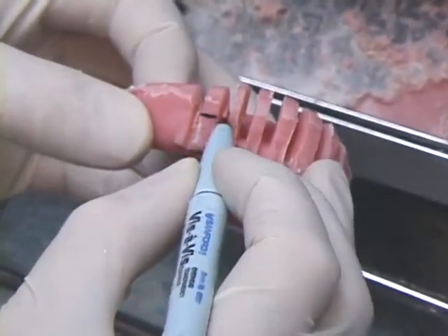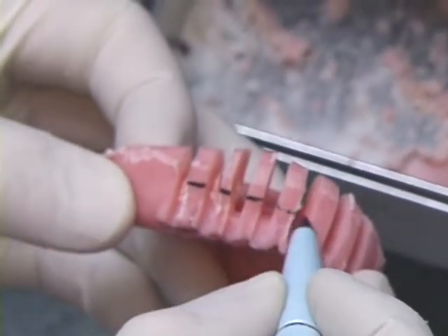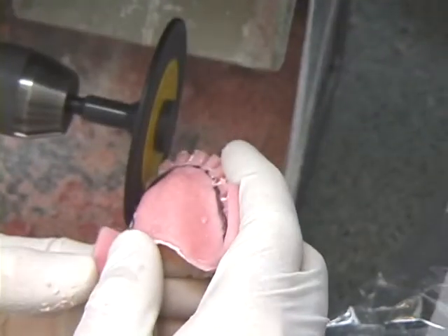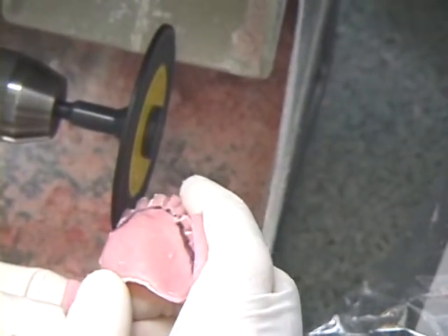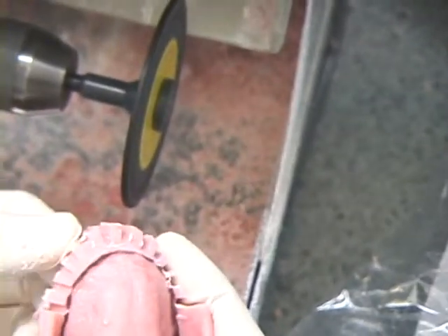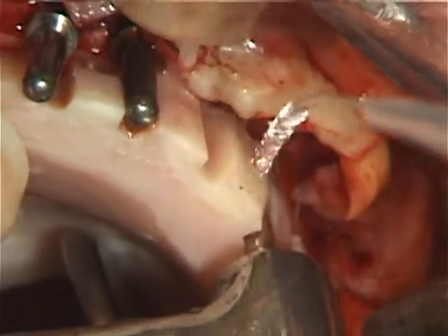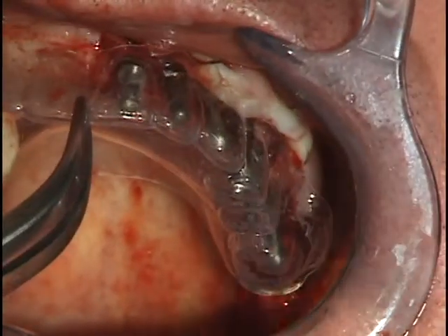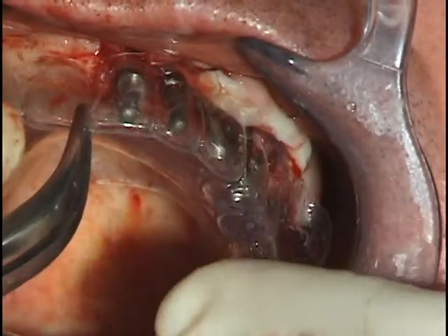To afford better visibility for the surgeon, the buccal aspect of the prosthesis is removed to the level of the central fossa or incisal edge and to the line corresponding to the greatest concavity of the alveolar ridge side of the prosthesis. A slot, slightly wider than 2 mm, is made in the long axis and center of each tooth, which will act as a guide for the pilot drill.